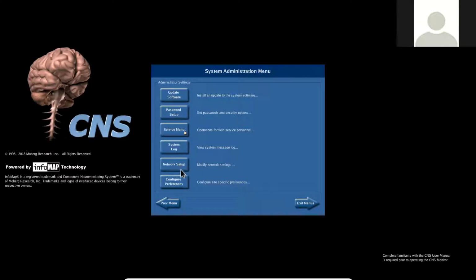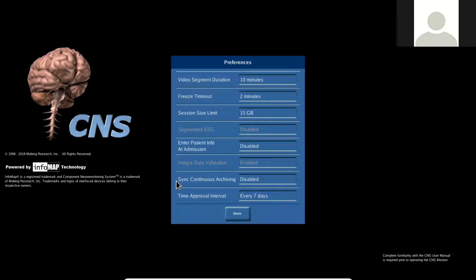So we're going to talk about networking a little bit more. Lawrence is saying, yes, that's so true. Right. Exactly. Okay, I'm going to show you one more little spot here in system administration, and then we're going to switch over and talk even more in depth about data. So that's good.